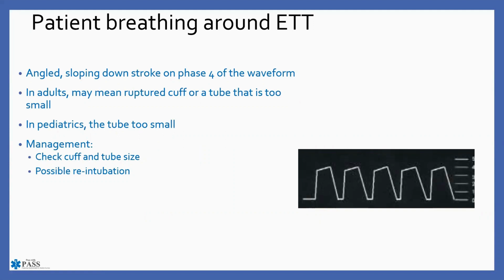And if the cuff is okay, then you need to be looking at increasing the size of your endotracheal tube. One thing that comes up in continuing education sometimes is, all right, if I had this, would I pull it? My personal opinion is no. If you have a patient that has been intubated in the field by you, and you see a waveform that looks like this, I would leave that thing in.